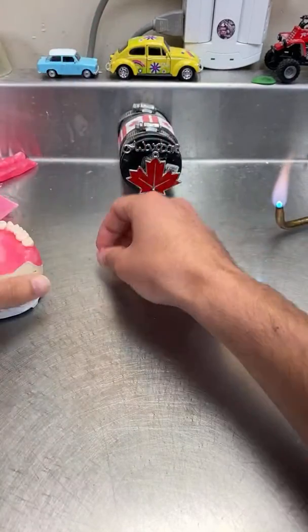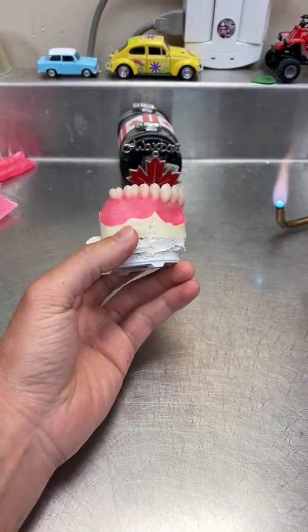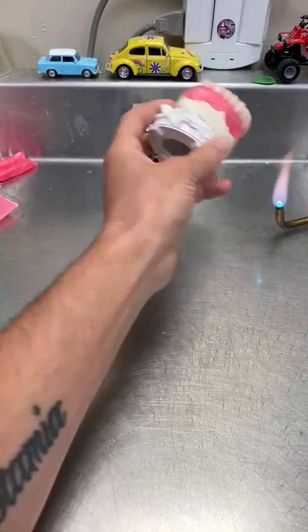So here's a trick for you. Because this is cold now, the wax is cold, I'm gonna warm it up a little bit so it doesn't delaminate.